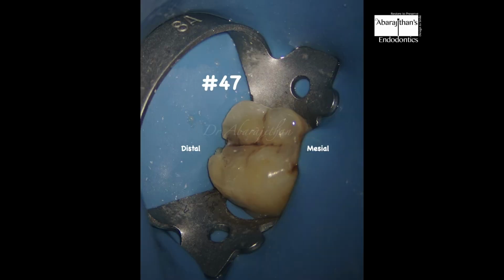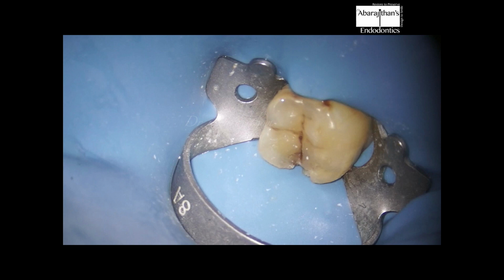So here we go. As I mentioned earlier, we have two cases with two different representations. The case number one is the mandibular right second molar, tooth number 47 with distoproximal caries, and this is the preoperative radiograph. So apart from showing you the anatomical representation, let us also discuss about how we went about this case clinically. I will also show you the workflow of these cases.